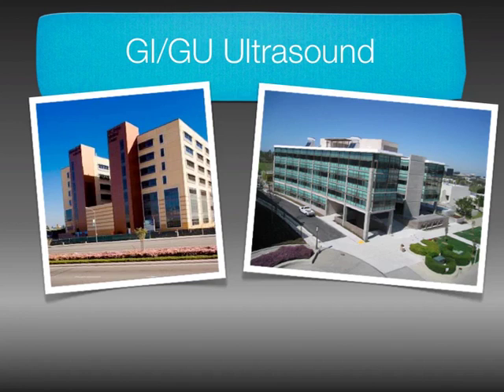Okay, we're going to talk about GI and GU ultrasound today, and the goal, of course, is to try to get you as prepared as possible as we transition from the building that we're currently in here, and as you move from the second year into the third year, which is this building over here, which is the hospital, obviously. And it's not just that building, it's also clinics and wards and the VA and all these other places in Long Beach. So that's the concept, going from the classroom to the patient, and that's where this ultrasound stuff fits in.